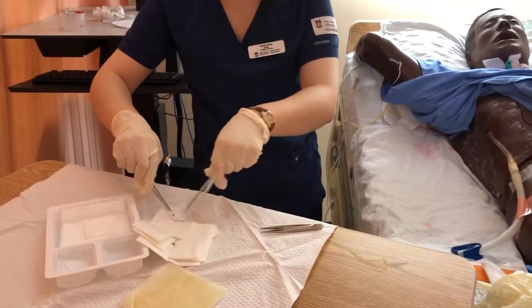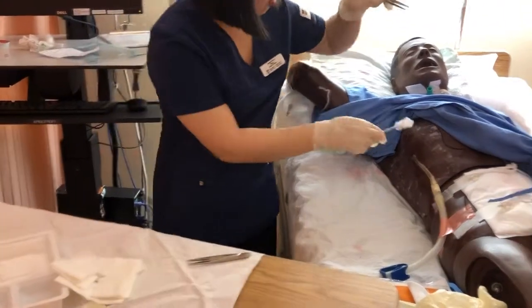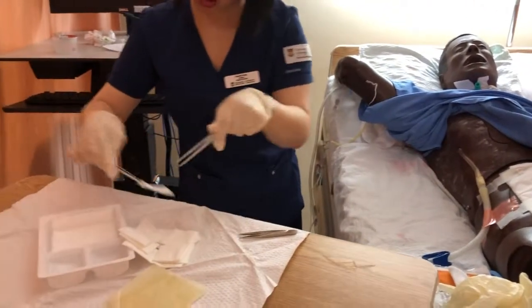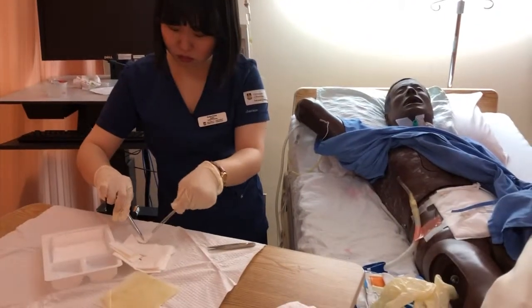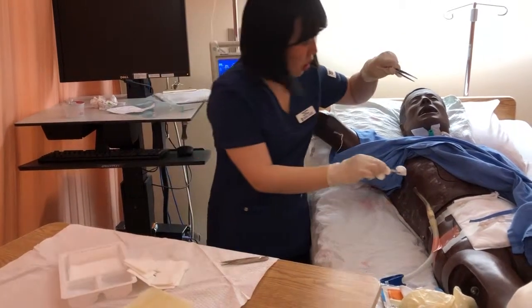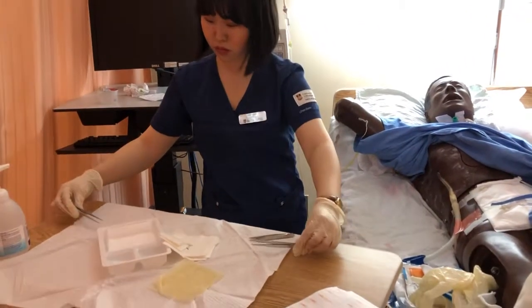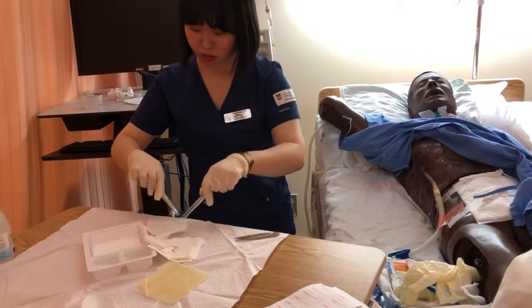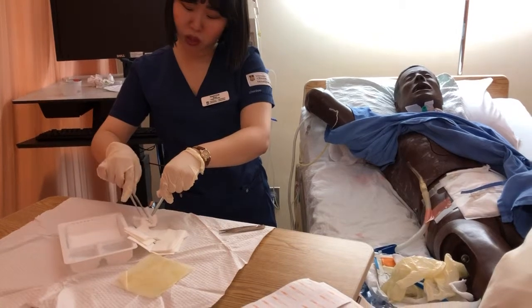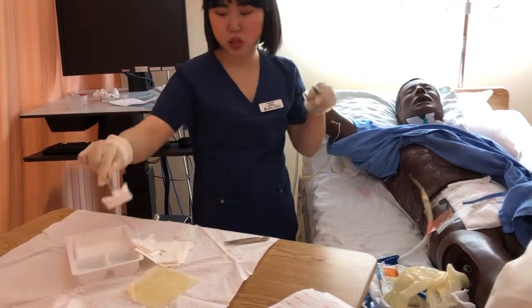Just like forgetting some things and just swiping too. Dip it in. Third one goes larger, and the last one, dip it in and clean the tubing. And I'm gonna dry. I kept forgetting things. For more information, when you're checking the air leak, you don't want to clamp for more than 15 seconds for patient safety.